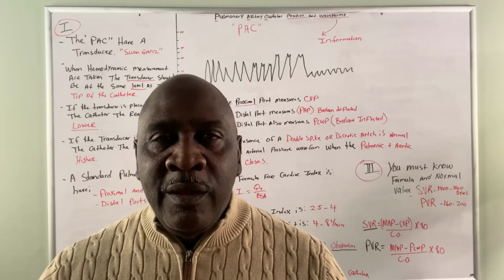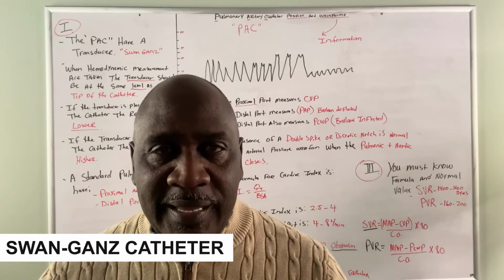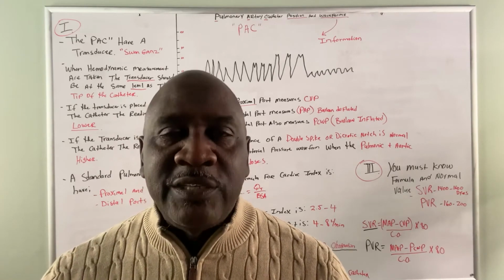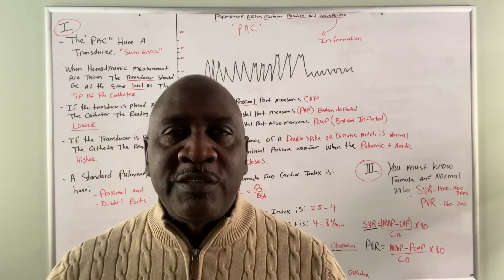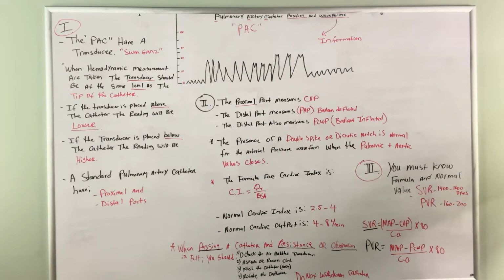Now tonight, we are talking about pulmonary artery catheters or Swan-Ganz catheters. This information is essential for the TMC exam, things that you must know. Are you ready to go? Let's do this. Okay guys, as always, I'm working from my left to my right on the board.